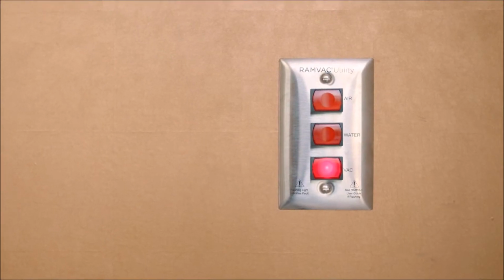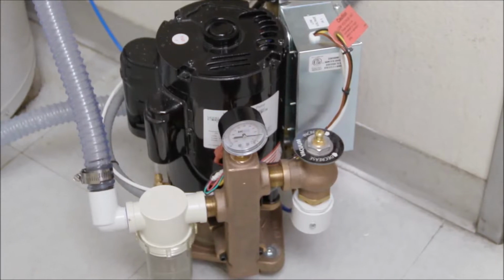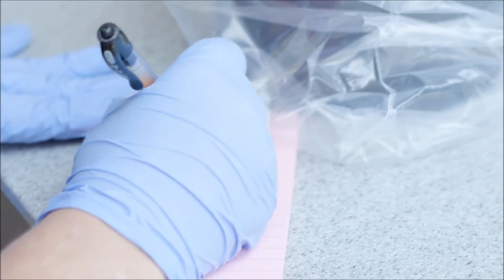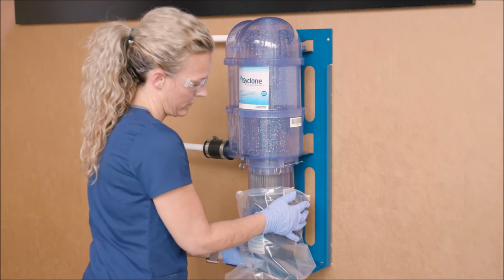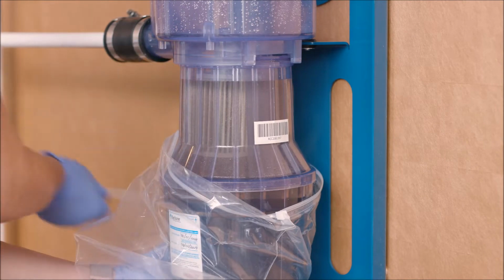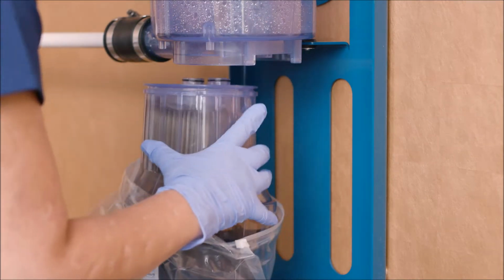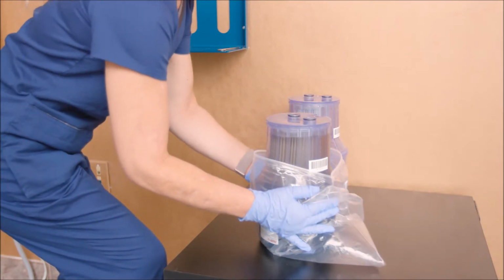It is important to leave the vacuum running during this procedure. Note the reading on the vacuum gauge. Slip the Ziploc-style bag provided under the used canister. Carefully remove the retaining pins and pull down to release the full canister from the top chamber of the amalgam separator. Keep the container tilted away from yourself.